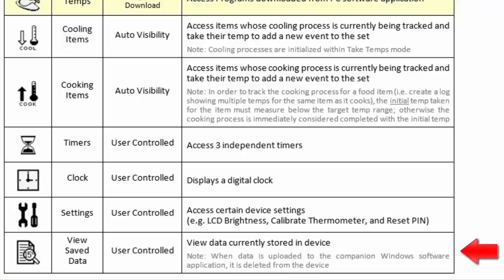The View Saved Data icon allows you to view all checklist and temperature events that have been recorded in the handheld, but have not yet been uploaded to the software.